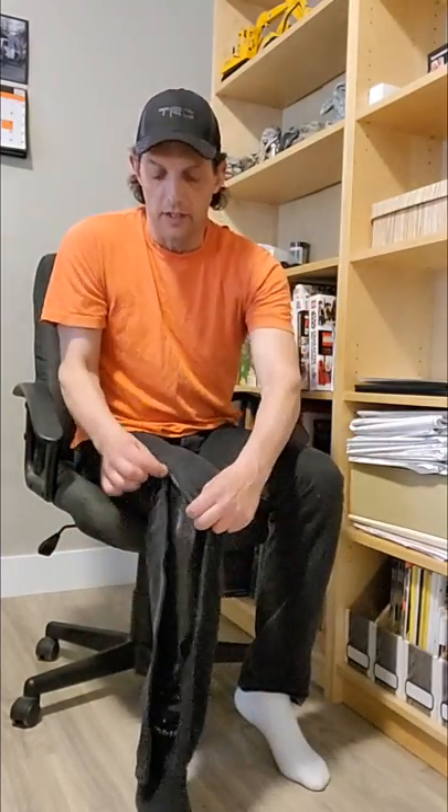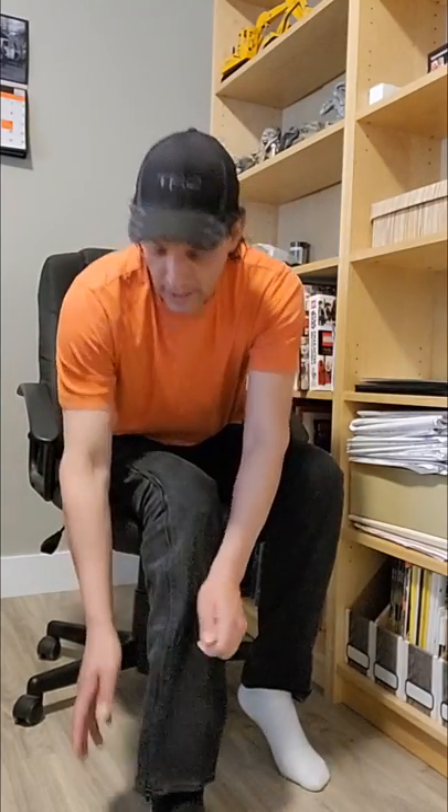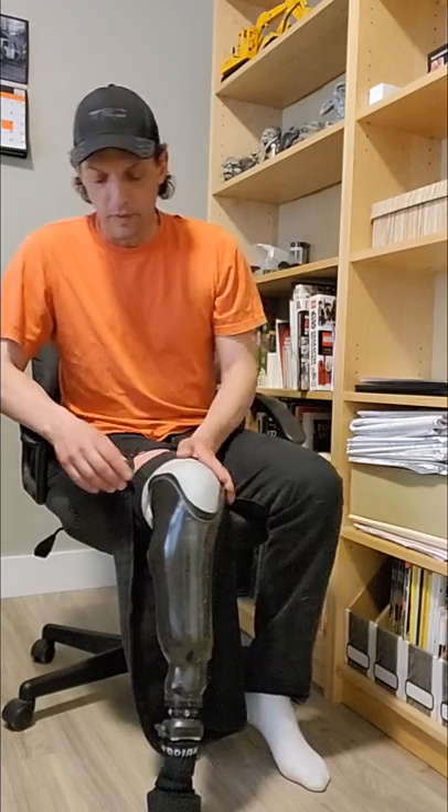Starting off, these are my regular Levi jeans that have been modified with a zipper along the out seam. You can actually buy from clothing companies that sell modified jeans, or you can find a seamstress who's talented at sewing to do that zipper for you — either on the out seam or sometimes the inner seam. It makes it a lot handier especially in a colder climate so you don't have to wear shorts or drop your pants in public to access your leg. It makes it a little bit more discreet and viewer friendly.